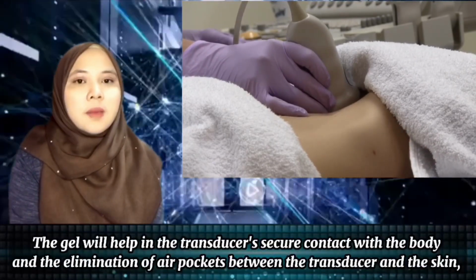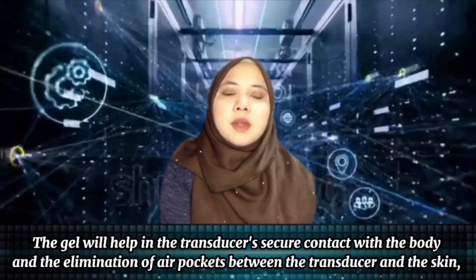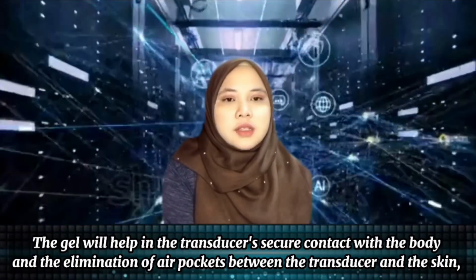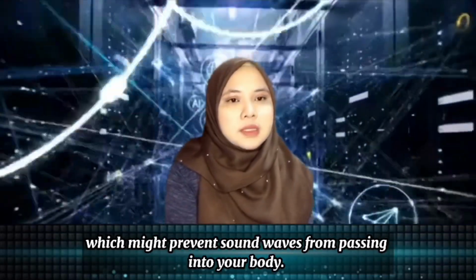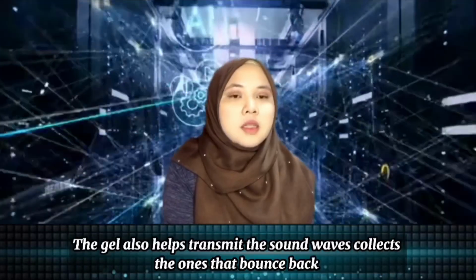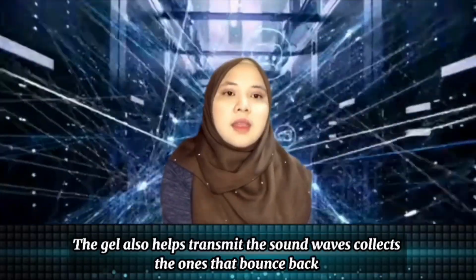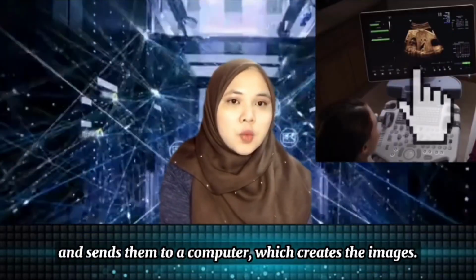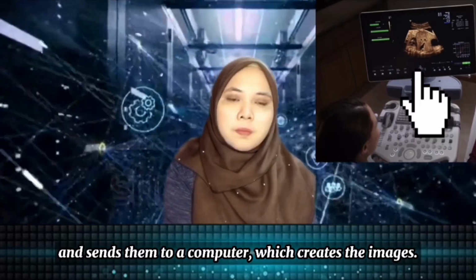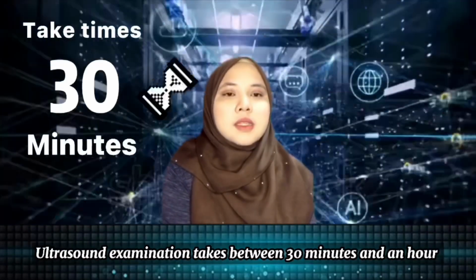The gel helps the transducer make secure contact with the body and eliminates air pockets between the transducer and the skin, which might prevent sound waves from passing into your body. The gel also helps transmit the sound waves that bounce back and sends them to a computer which creates the image. The ultrasound examination takes between 30 minutes and an hour.